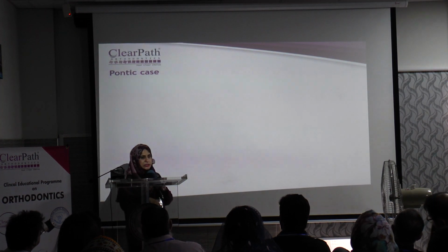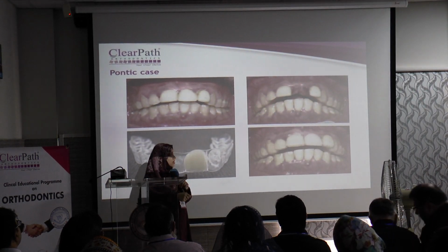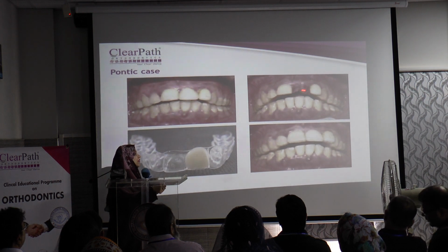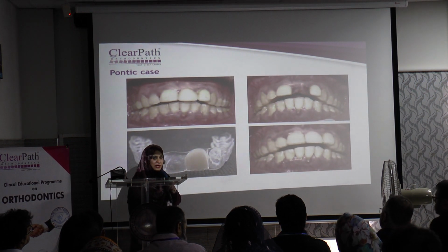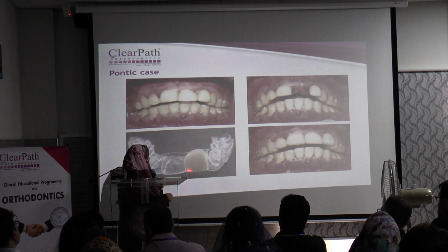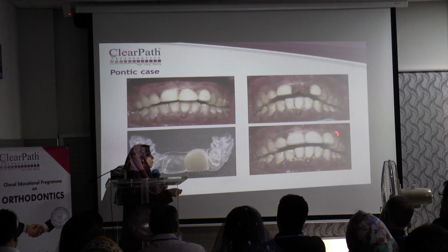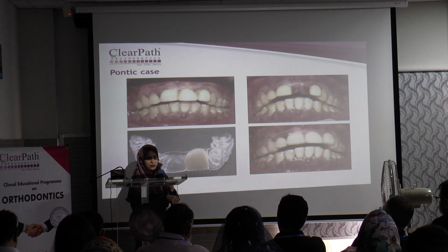Now the Pontic case. The Pontics can also be done with these aligners. Suppose the patient has gone for some sort of extraction and the prosthesis cannot be inserted immediately, and the patient has to attend any socially sensitive occasion or anything. So we can also insert a Pontic and place it. So that's really pleasant aesthetically.